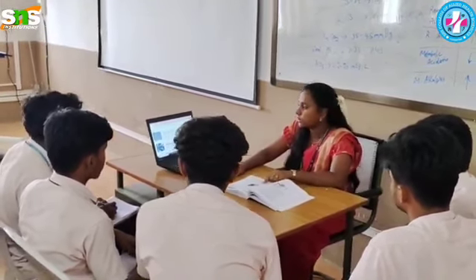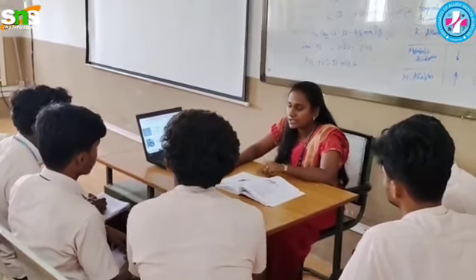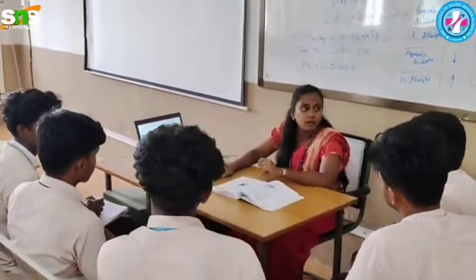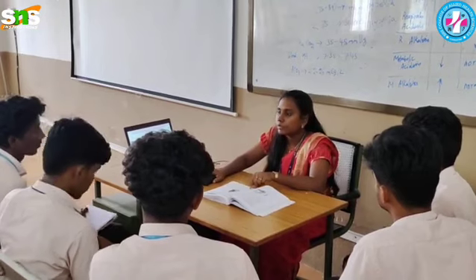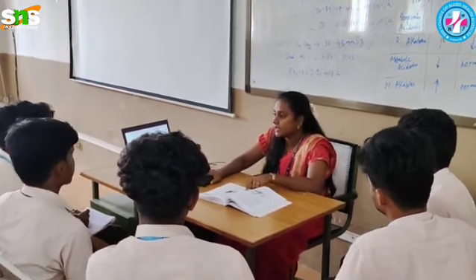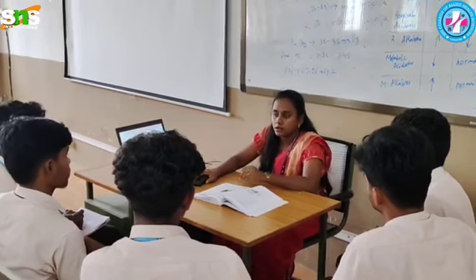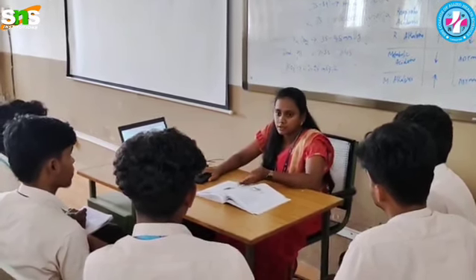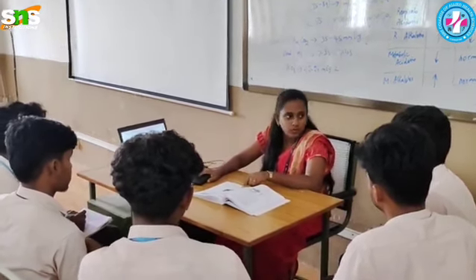Okay. So the word tomography is derived from the Greek word. Tomo means a slice and graphy means to write. So tomography was used to visualize the human body's internal structures, the internal organs, and to identify abnormalities. It was very useful for the radiologist or the other surgeons or physicians to visualize the abnormalities easily. CT scan was invented.